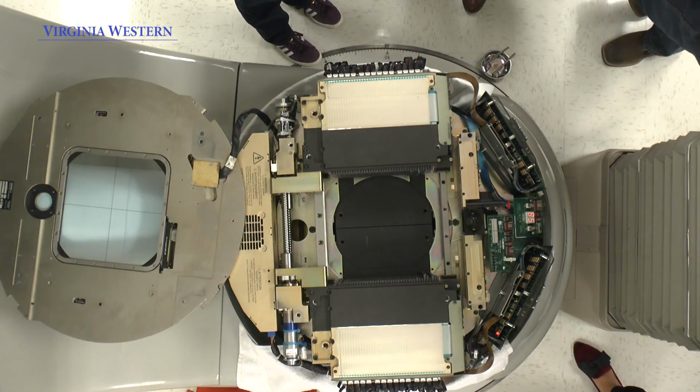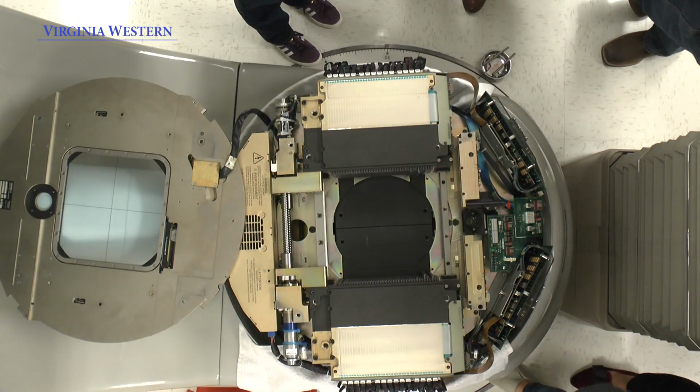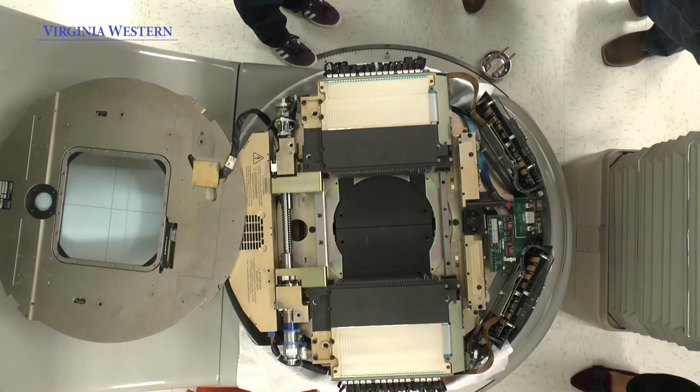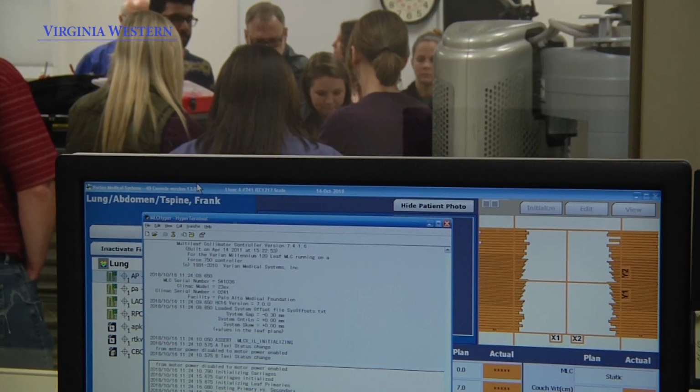Okay, so this is a good learning opportunity. One thing we haven't done is we haven't switched off the service panel. But it depends how quick the software was if it caught it. So turn it off. No, we'll see if it still initializes.